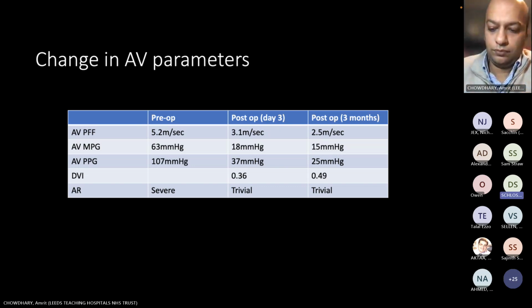There was concern. The discussion was because he has a mechanical mitral valve in there, and I think his initial valve was 21 millimeter. Is that right? His initial valve. So the question, and he's a young chap, so there was the fear, what kind of size valve will we get in there? And there was a fear of creating prosthesis-patient mismatch. And again, that was something to be considered.